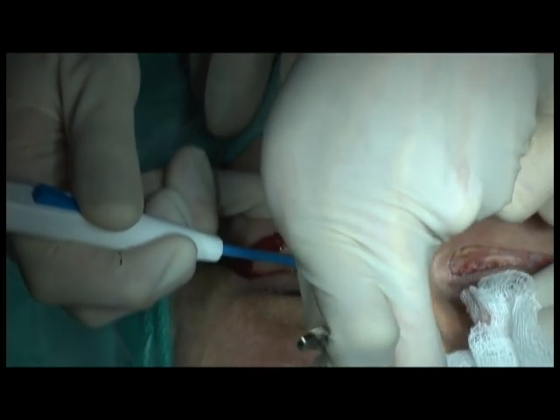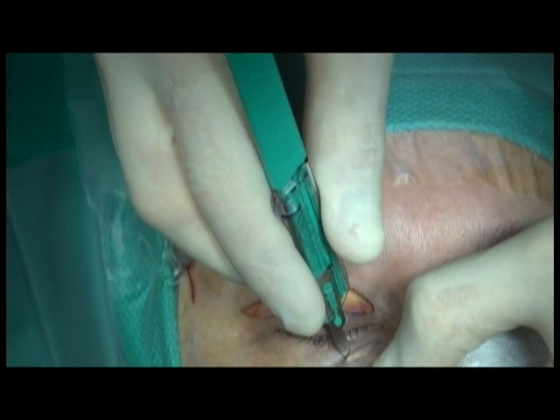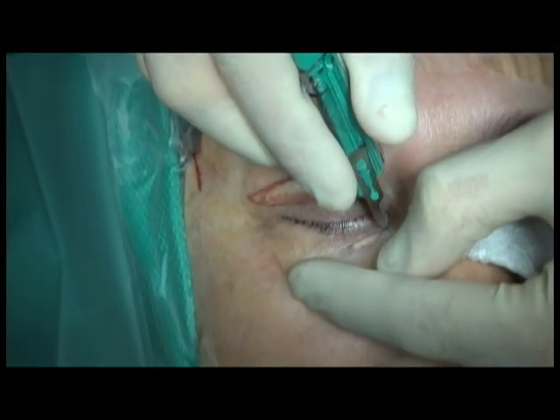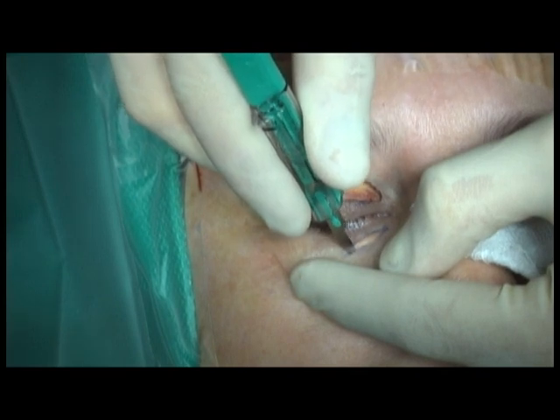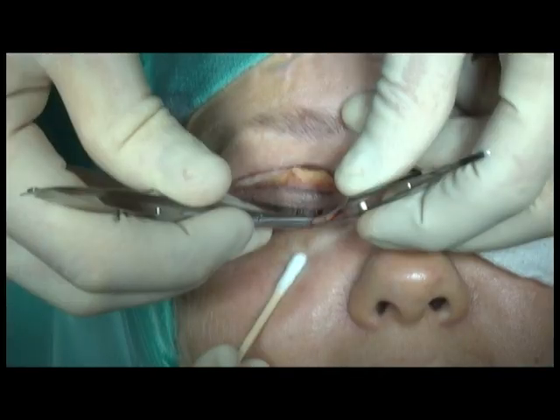Attention is then directed to the lower eyelid xanthelasmas. A 15 blade is used to make an incision around the xanthelasma. The skin excision in this area should be conservative to prevent postoperative ectropion.